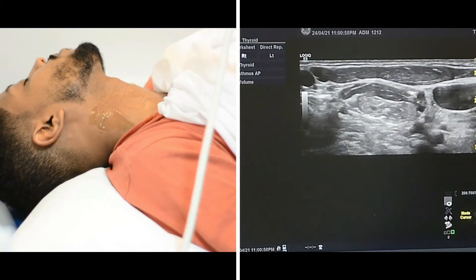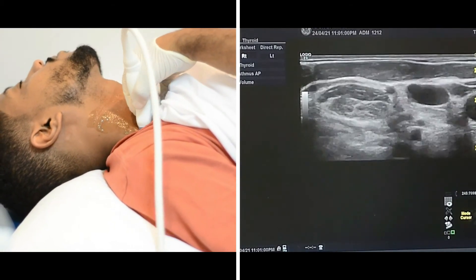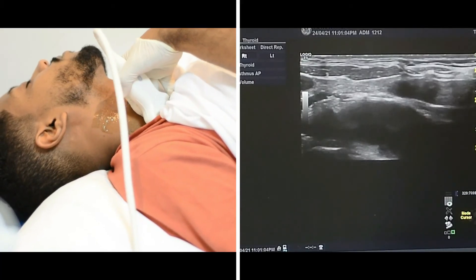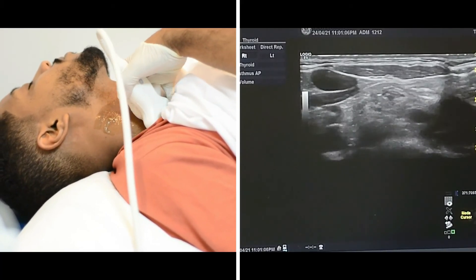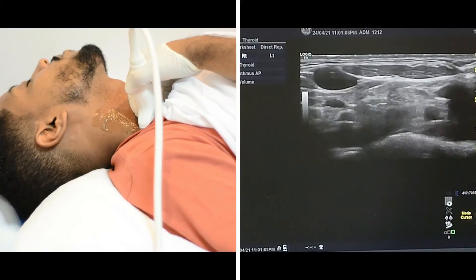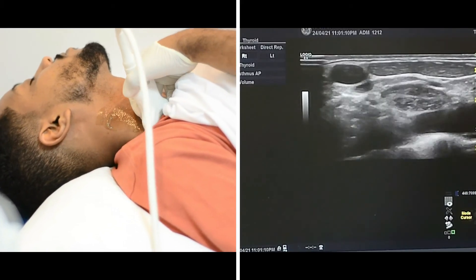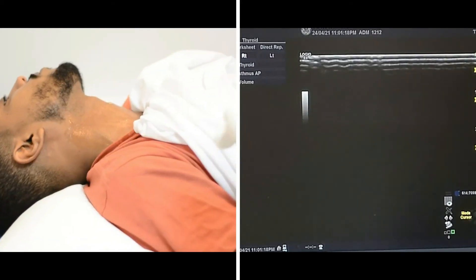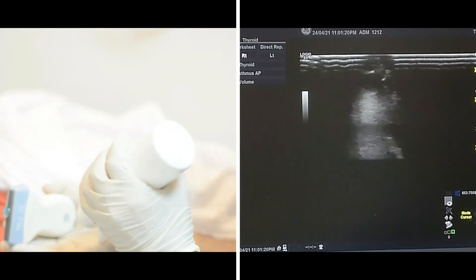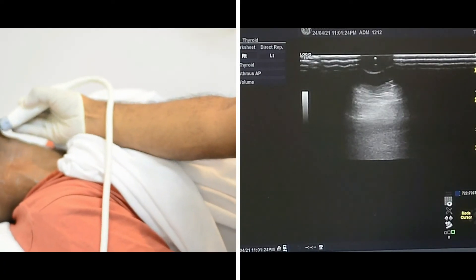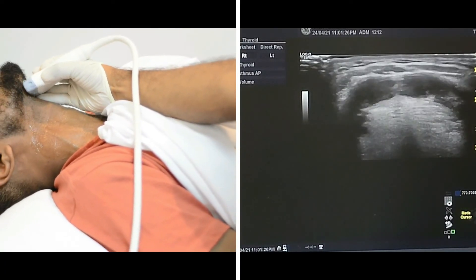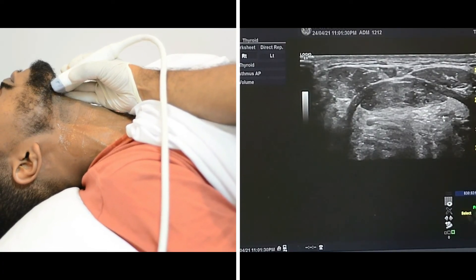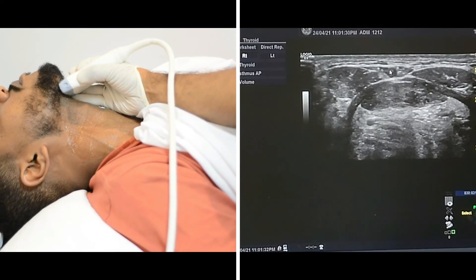The most important thing is that you have to check the supraclavicular region by positioning the probe like this, looking for supraclavicular lymph nodes. Here, no suspicious lymph nodes are seen. I also check the other supraclavicular region similarly, looking for lymph nodes. As we can see here, there is a supraclavicular lymph node which looks normal.